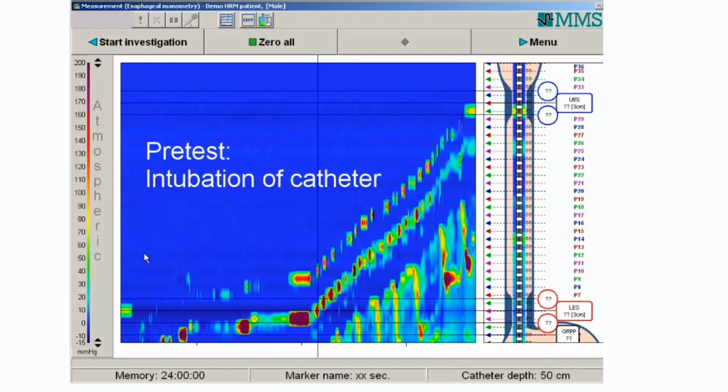Okay. So how will I know that everything's okay? If I did the calibration, how will I know that the calibration was done correctly? Once I press zero all, all the readings on the screen should be zero. You can see here the scale, we will know it by the color. If it is zero, it should be a little bit dark blue. So all the lines will be dark blue.